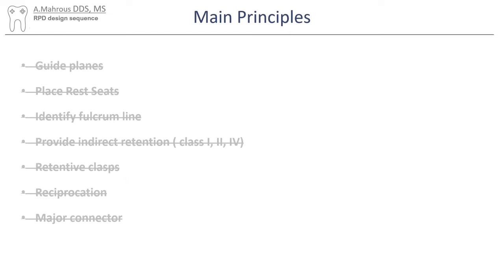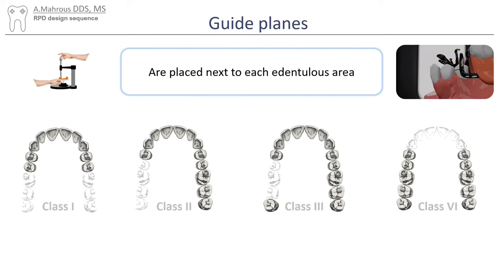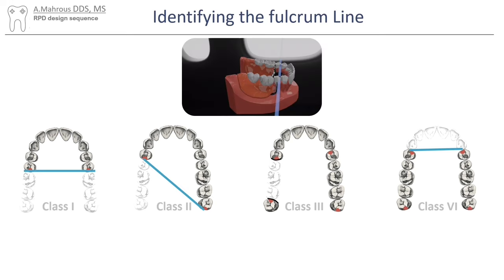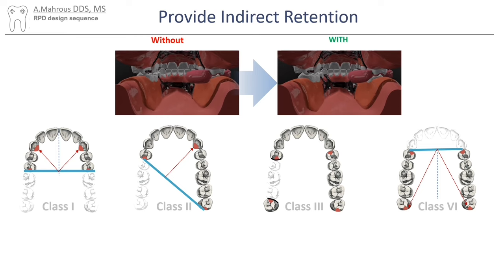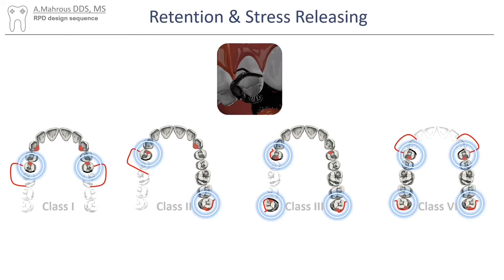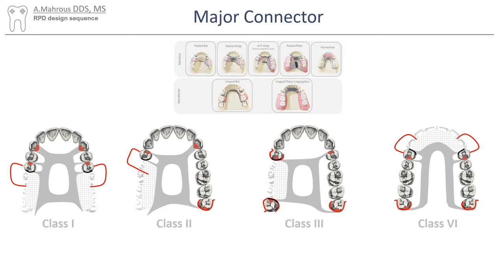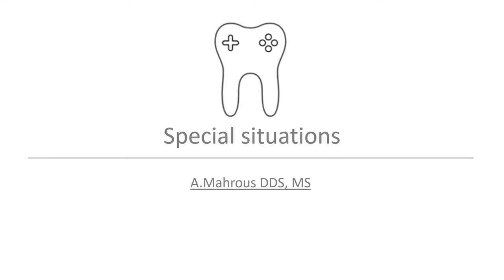With that, the steps of designing an RPD are complete. So let's do a little recap. The first thing that's added are the guide planes, followed by the rest seats, then identify the fulcrum line, and then use it to determine where to place our indirect retainers. Then we add the retentive clasps, we add the reciprocal elements, and finally the major connector. Now that we have a basic understanding of RPD design, it's important to point out a few special situations.